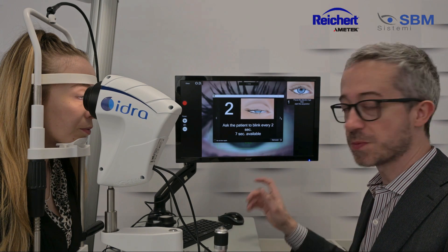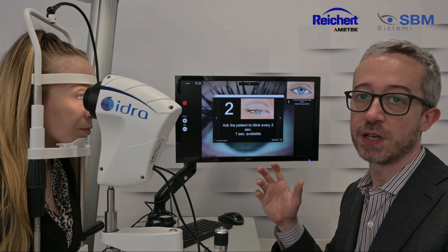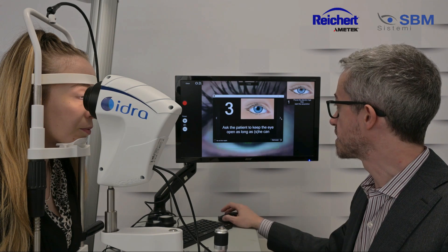In the first part of the video, approximately seven seconds, we will do the acquisition of the Interferometry, so we have to close and open the eye every two seconds. In the second part of the video, it will be acquiring the NIBUT, so we have to keep the eye open.